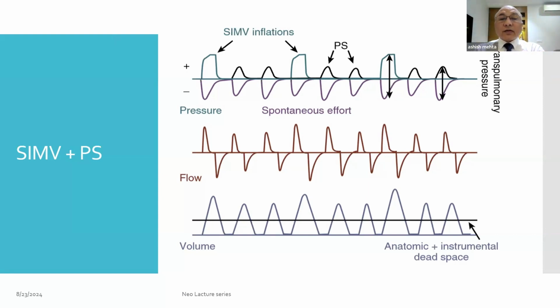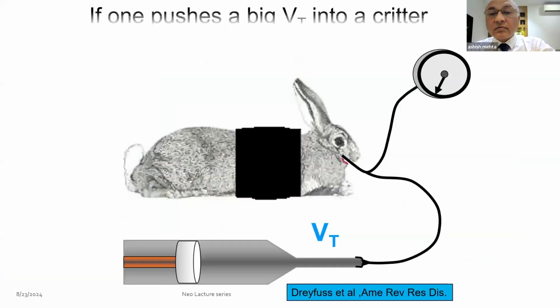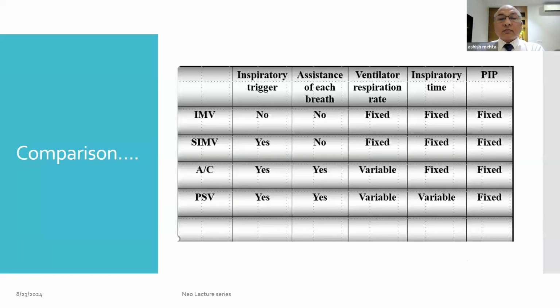Now you can see here that during this part, there is some pressure being offered through which the baby can breathe easily. There is no increased work of breathing. The baby will not get tired or fatigued. Ultimately, the PS breath will take over the burden of that extra work. In short, I have some fluctuation here, I'm sorry for this.